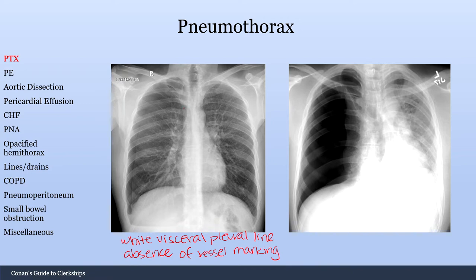The big thing with pneumothorax is that you want to check if the patient is having a tension pneumothorax — a pneumothorax that has enough pressure to cause a mediastinal shift. You can see the heart is being pushed to one side of the body, which can cause hemodynamic instability and is life-threatening. The way to tell if a patient is having a tension pneumothorax is to check for mediastinal shift.